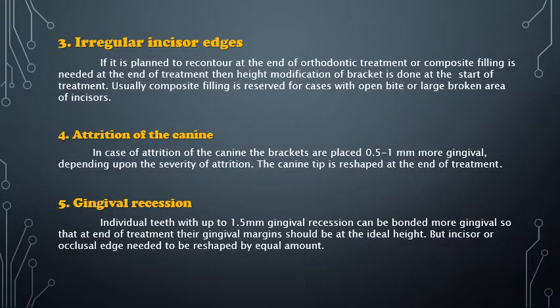Irregular incisal edges. If it is planned to recontour at the end of the orthodontic treatment or composite filling is needed at the end of the treatment, then height modification of the bracket is done at the start of treatment. Usually composite filling is reserved for cases with open bite or large broken areas of incisors.